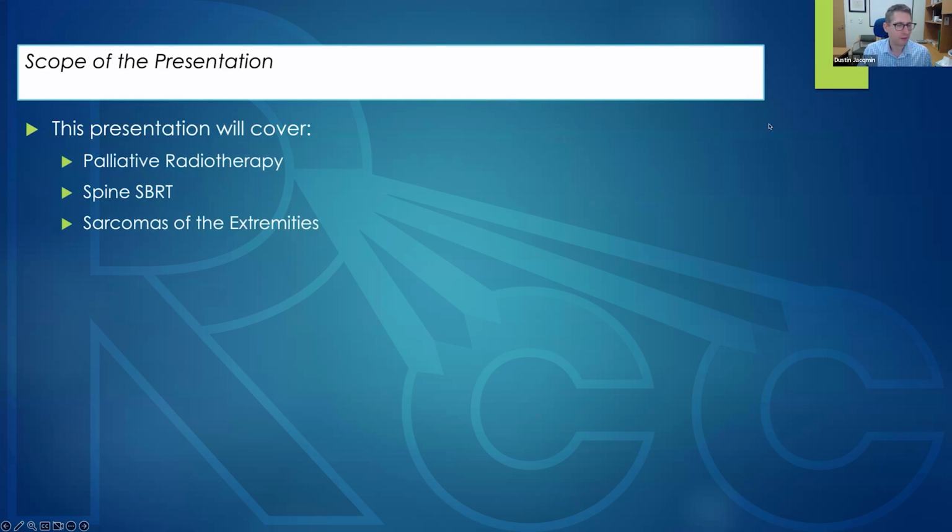All right. So this presentation is a collection of a few different topics that we chose to put together into a single session. You've been going through this physics plan review process, this checklist, many weeks in a row. And I think by now you've all seen it so many times that you could probably do it in your head. So this is an opportunity to focus in on a few topics and pick some major themes within those topics. And rather than going through the entire checklist for each of these topics, we'll highlight some of the most unique and distinctive issues related to reviewing plans within these categories.